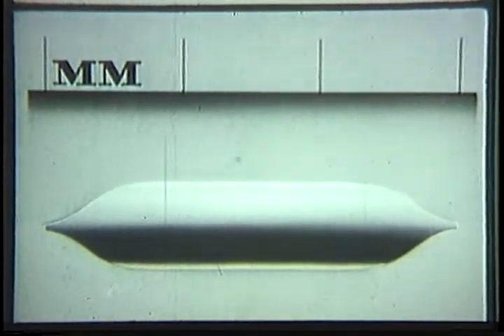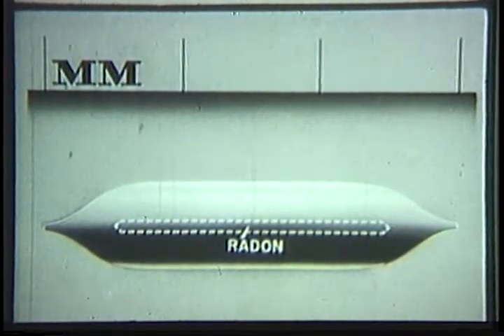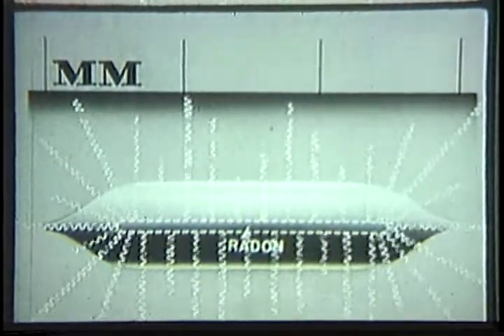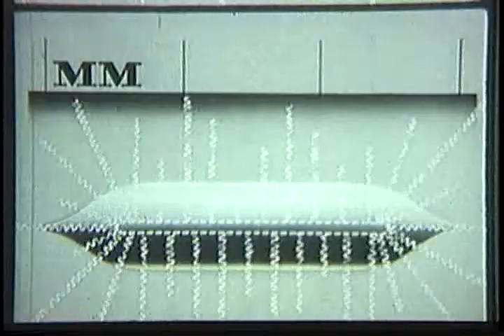A radon seed is a tiny gold capsule in which a gas called radon is sealed. The gas comes from radium and is radioactive. Radiations from the gas have the same effect upon malignant tissue as X-ray radiations. But a radon seed can be implanted inside the tissue.